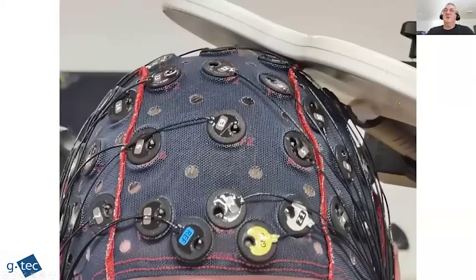Now, those who followed us last year probably noticed that we were using some red electrodes, which were a bit thicker, and we were developing these active electrodes, which are now 3 millimeter sticks, just like the passive electrodes.